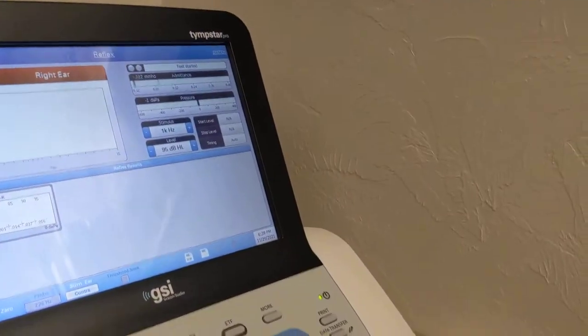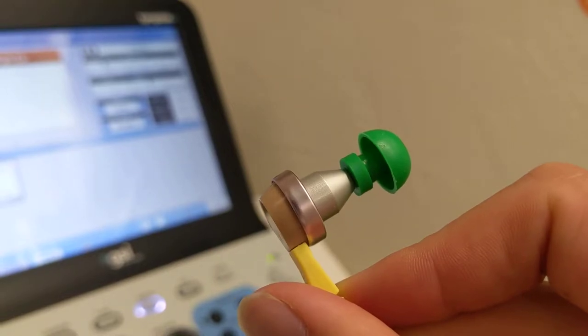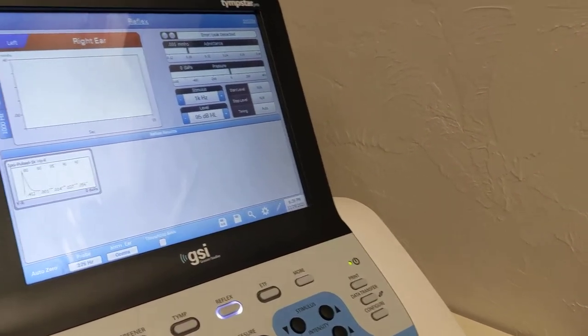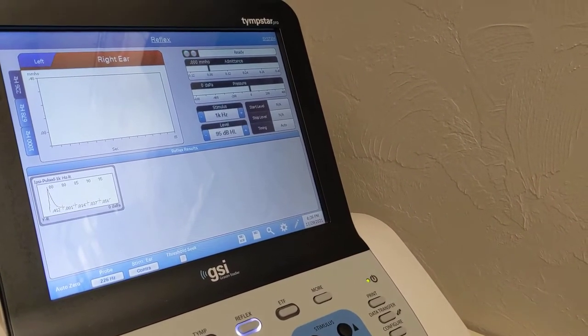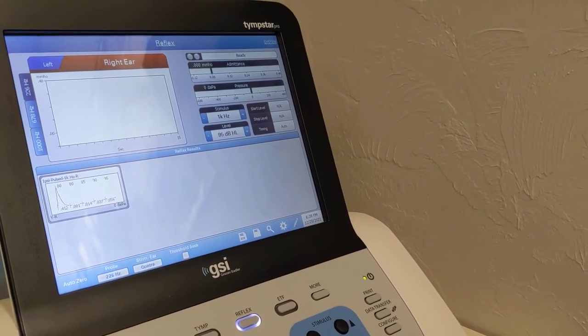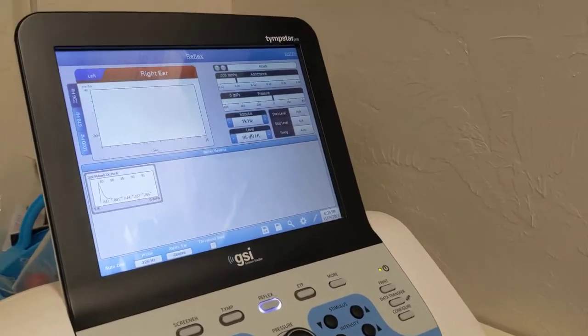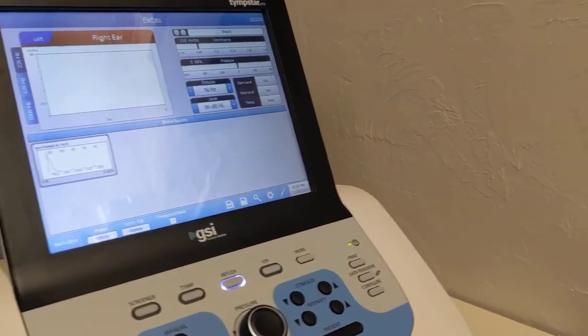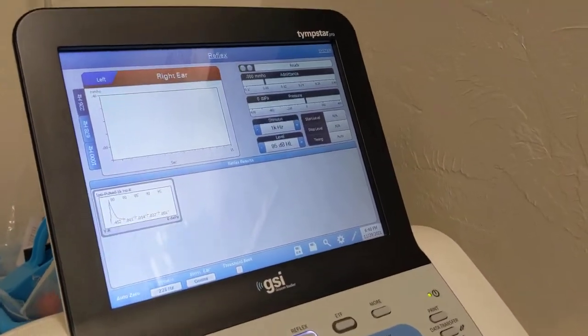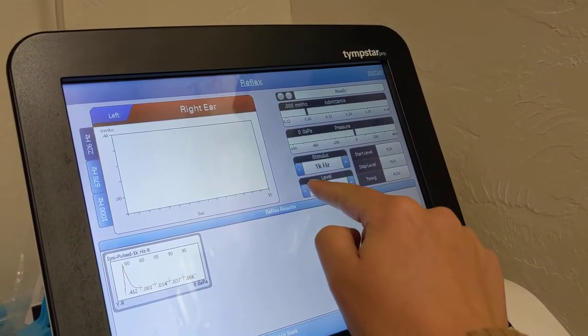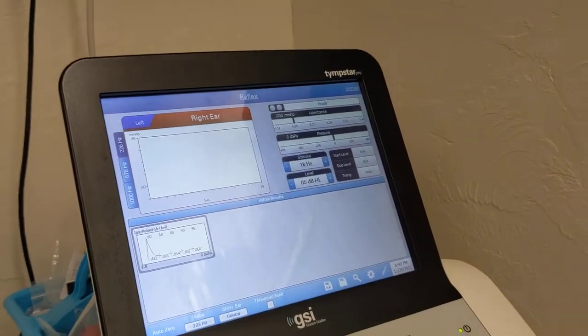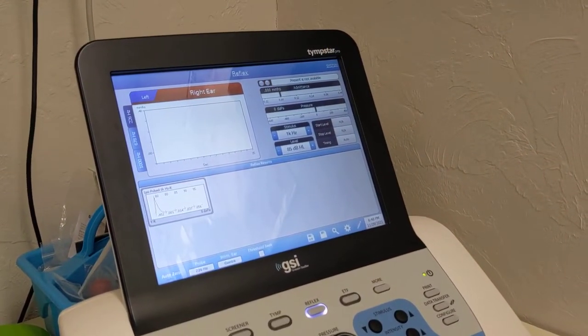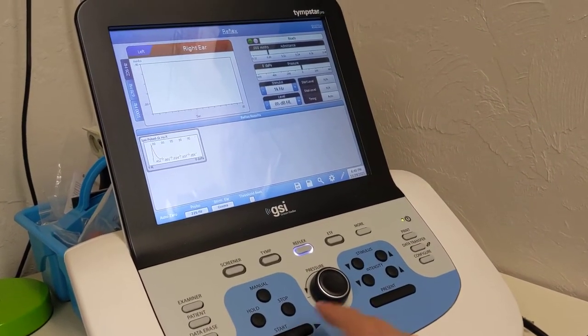So we're gonna put this one in my right ear and then the other probe in my left ear to measure the stimulus. Okay. So let's start at 2, 85 and present. Hit start and then present.